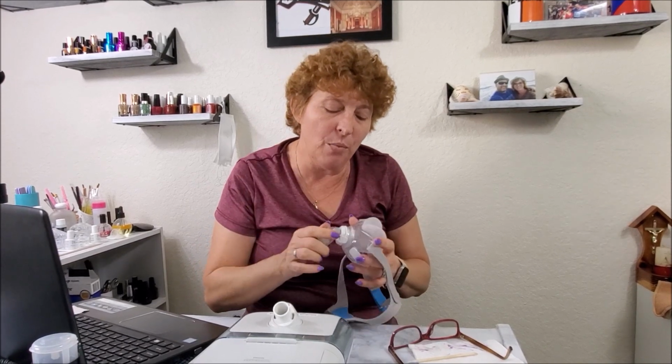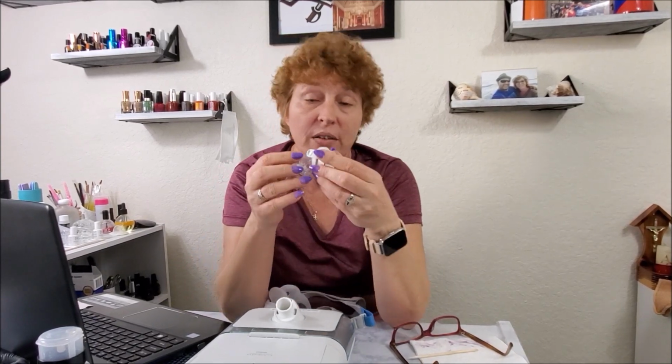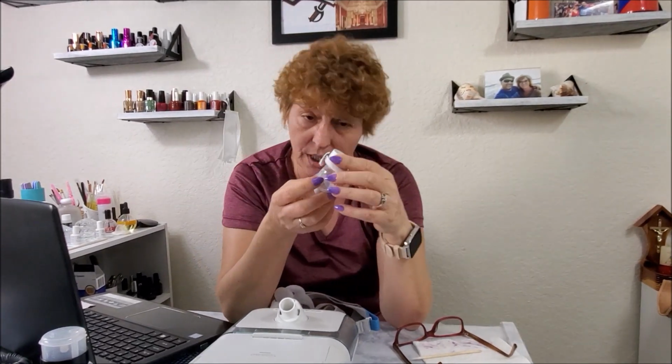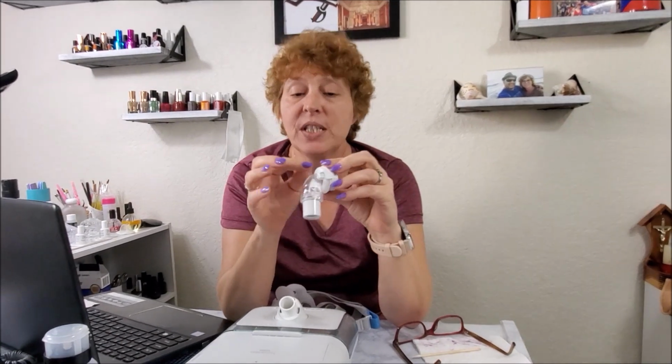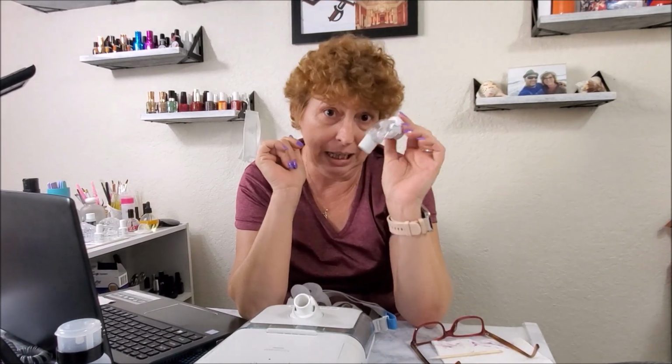And anybody that wears a CPAP will tell you, when this little device here, which is like a filter, well, it is a filter, this thing starts to get clogged, cameraman will tell you, you ain't sleeping. Because it just sounds like one bad bird snoring all night long. Yeah, I'm sorry, snake.